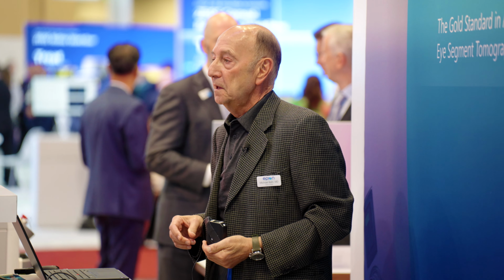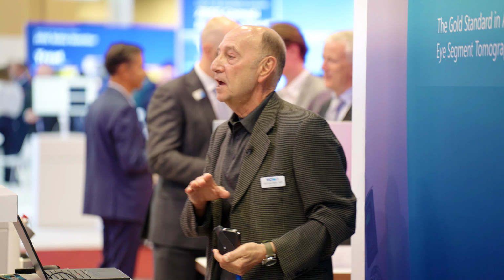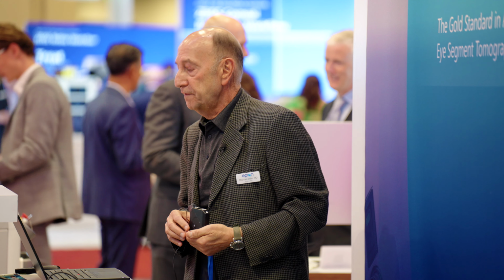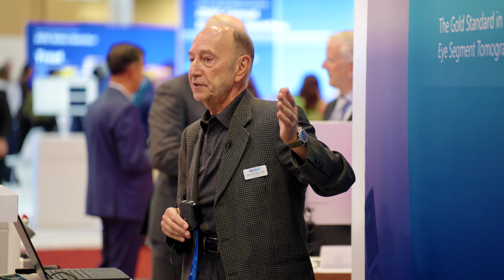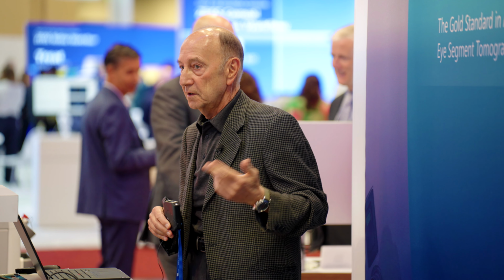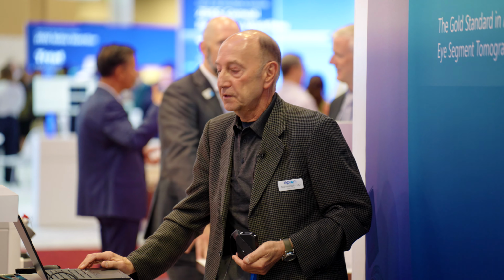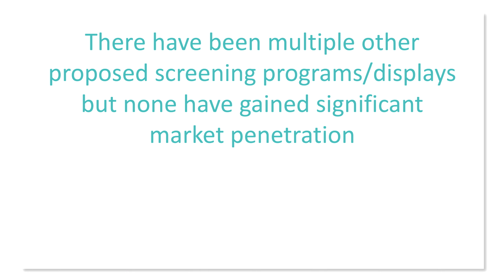I'll be honest with you, the progression display is a lot easier to look at than doing this. But if you want to do it, you can do it. The advantage of this is you can choose almost any display to compare. You can do elevation, curvature, or corneal thickness. So that's okay.